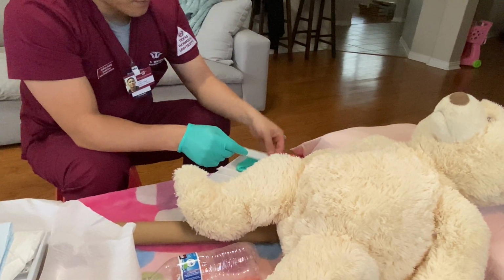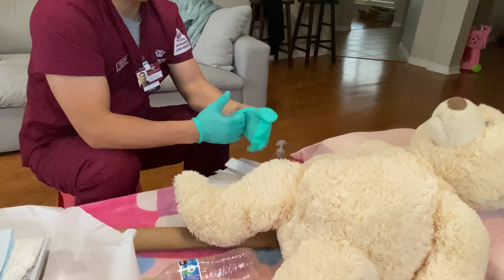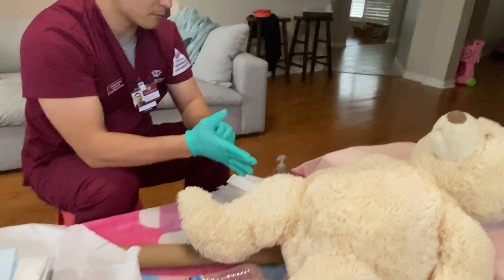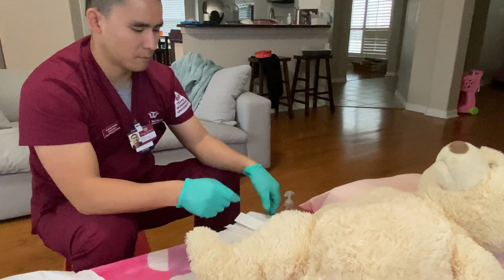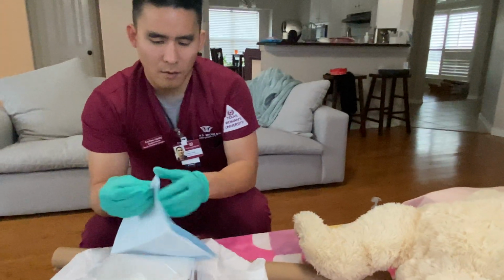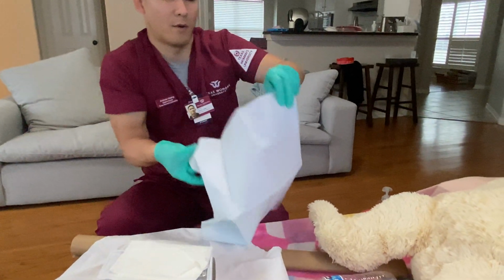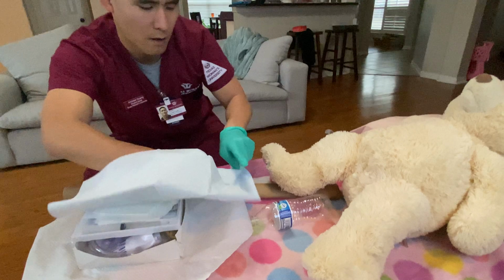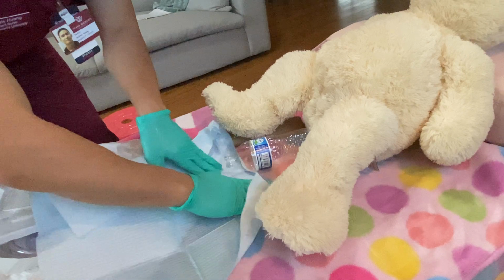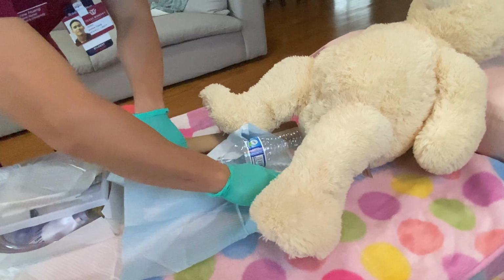So I'll grab this packaging. Now I will put my sterile hand inside the cuff and put the glove on my non-dominant hand. Okay. And now my hands are sterile. And so now I'll get the sterile pad, wrap it around my hands here, place it underneath you, and this will create a sterile field underneath.